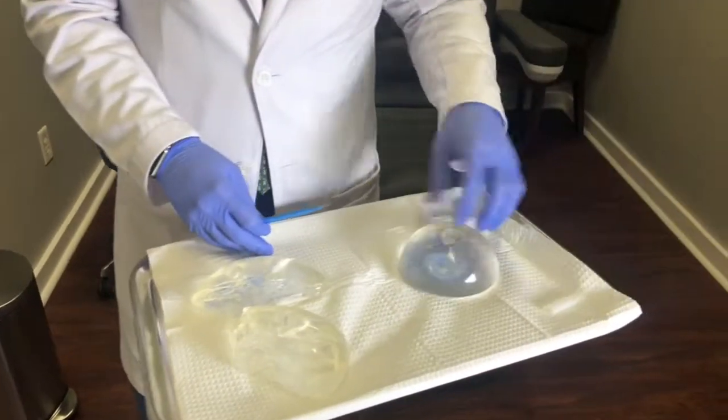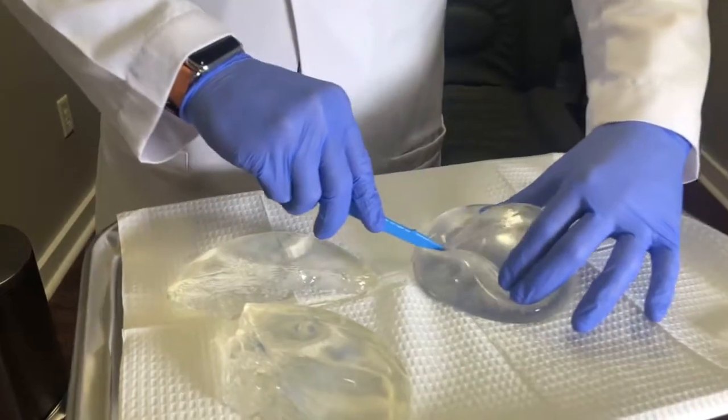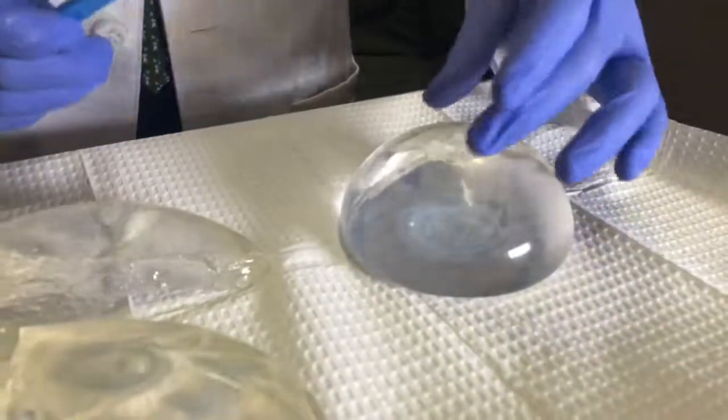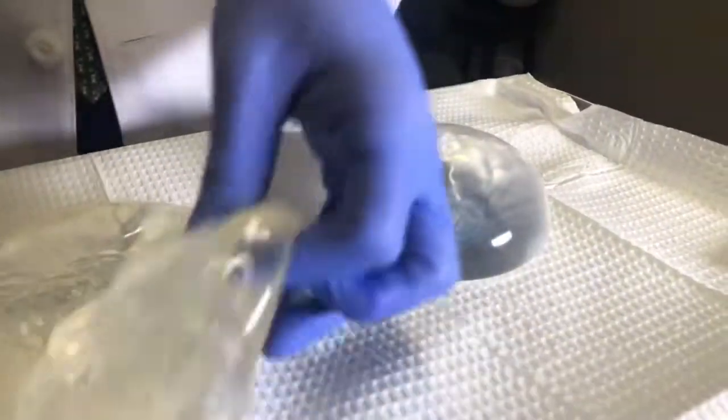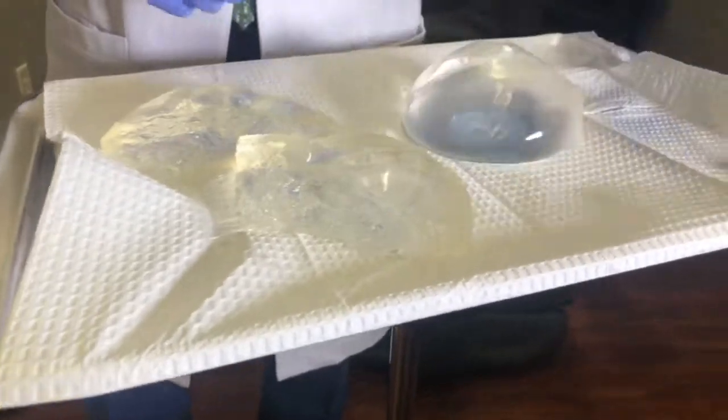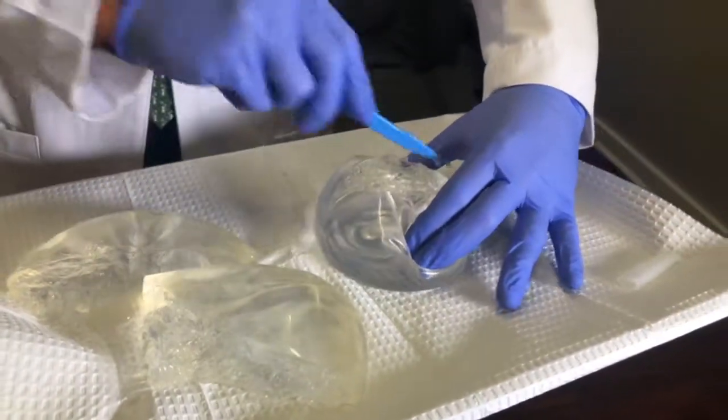So this is a modern cohesive gel implant. I'll cut this implant, and you can see how this implant goes right back, whereas this older implant is already kind of sticking to the table. This implant goes right back to shape, so I'll go ahead and cut this implant all the way through.